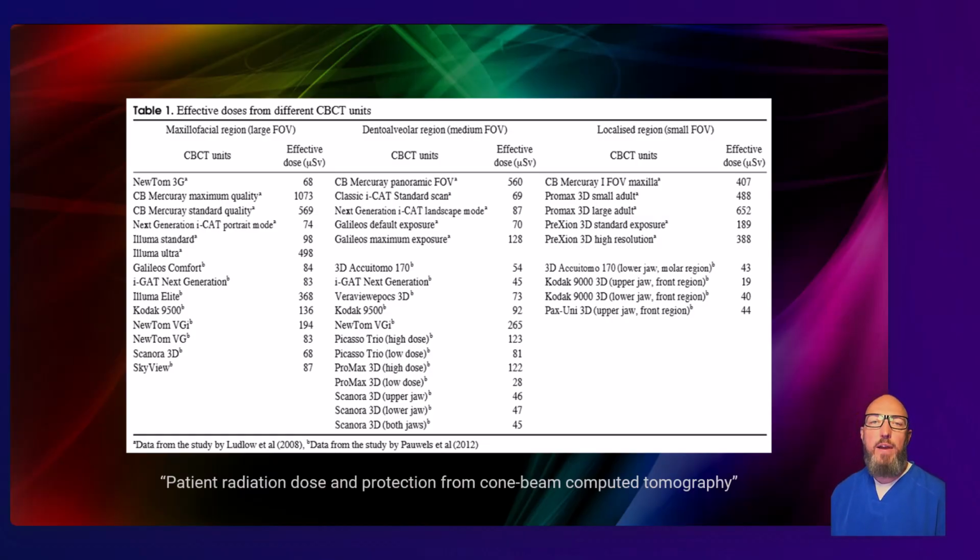And then number of acquisitions. Try to limit the number of CBCTs you do on a patient. And if the first one is diagnostic, you don't need to repeat it just because something didn't look perfect. And then always follow the principle of ALARA, as low as reasonably achievable. Same principle that applies to intraoral imaging. Justify every scan, optimize every scan.